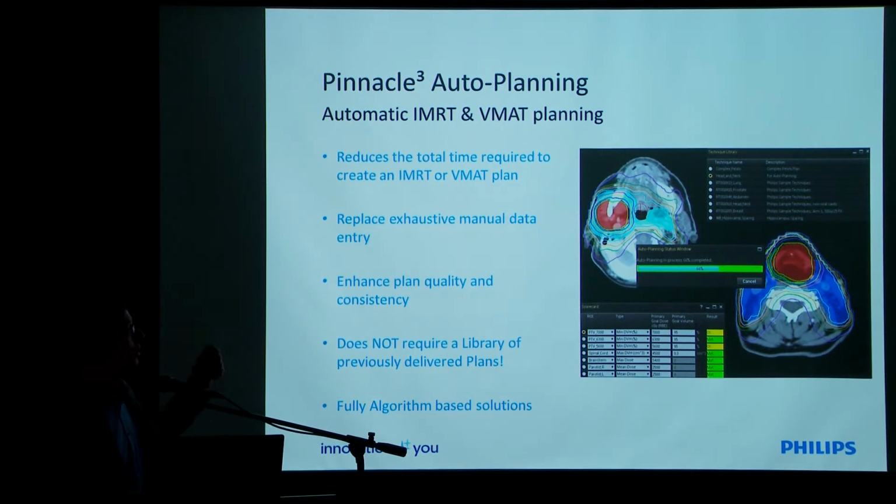Okay. So I'll talk a little bit about auto planning in Pinnacle, because many people ask me about this. Auto planning is automatic IMRT and VMAT planning. In this kind of planning, it's not like the traditional IMRT planning. We actually work with the clinical goals.